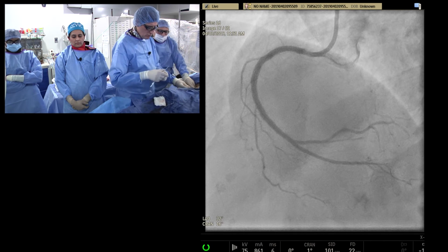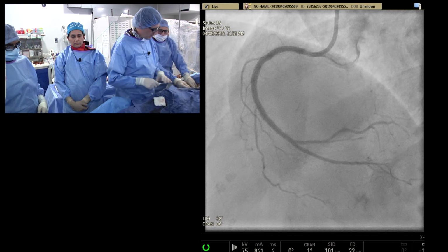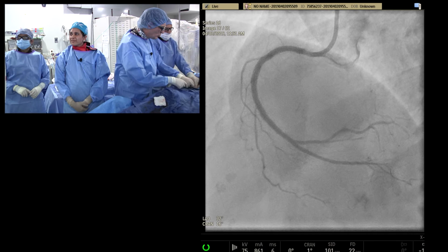Great. Any other questions? Yeah, we have another question in the back of the room. Can you guys stick with us? I know you were closing the artery. We're going to show us that too, how you close the artery. Yes. Arrange manual removal later on.